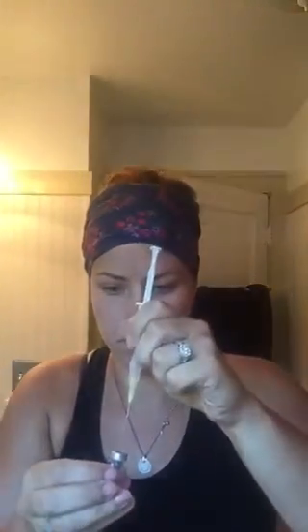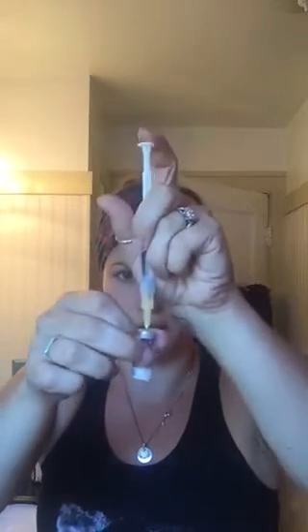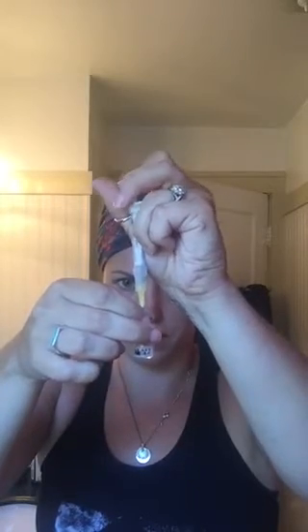So the solution's in there. I put on the loading needle. It's a very large needle. That's not what goes into my stomach. That's just what loads the medication, the little powdered vial in here. I'm just going to stick that right in the top. There's a little rubber hole on top. And then inject the solution. I give it a second.